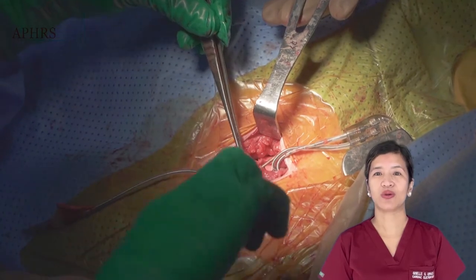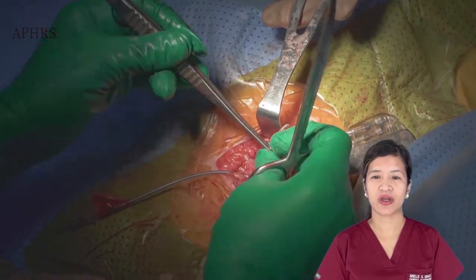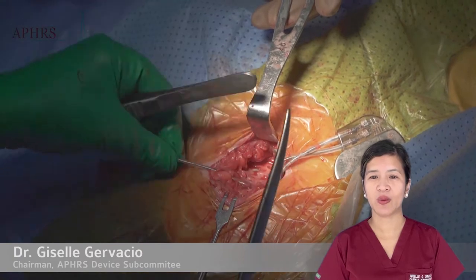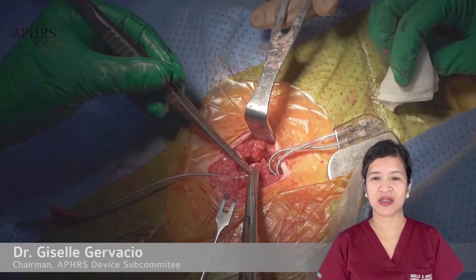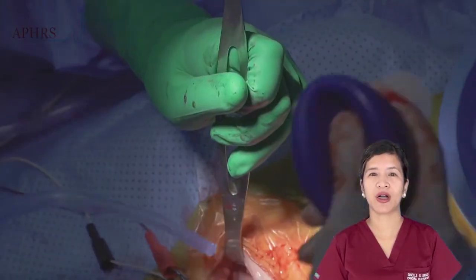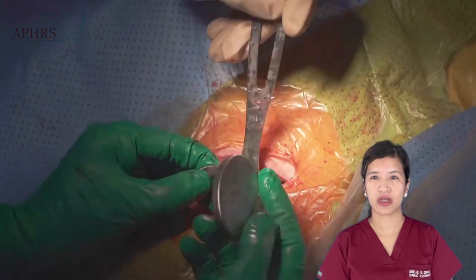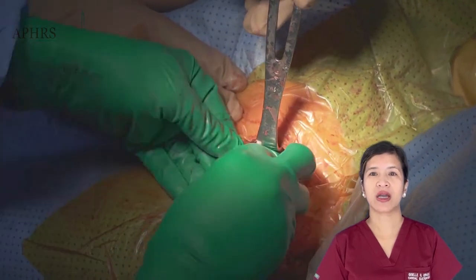Sometimes it may be necessary to enlarge the pocket for cases where the new generator is larger than the old one. It may also be necessary to add more local anesthetic to deeper layers of the pocket. After having freed up a significant length of the leads and defined the plane of the pectoralis fascia, we proceed to washing the pocket with an antibiotic saline solution and recording serial numbers of the leads to make sure they are not interchanged upon reconnection with the new generator.